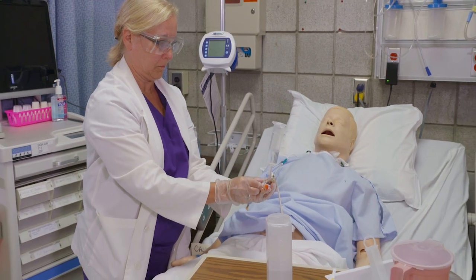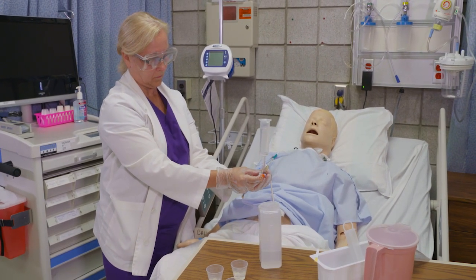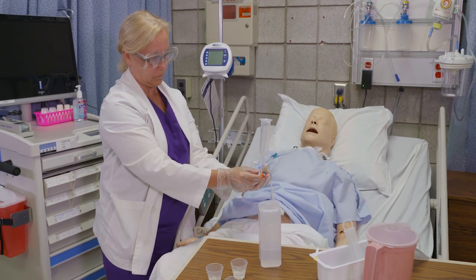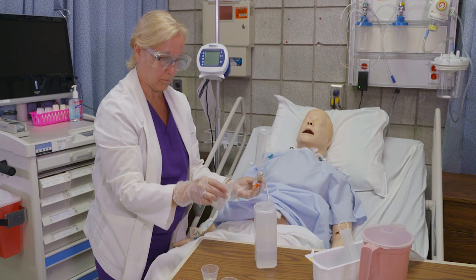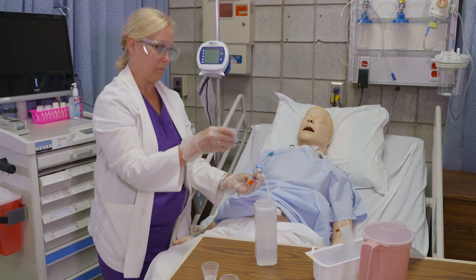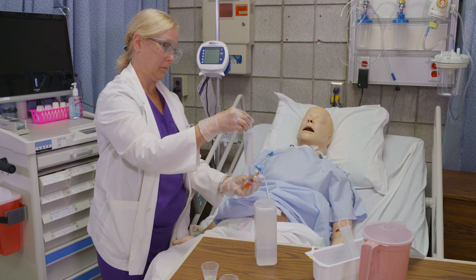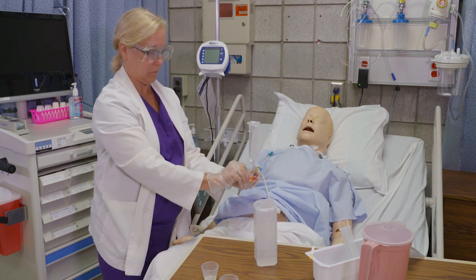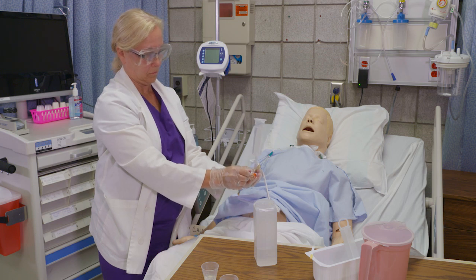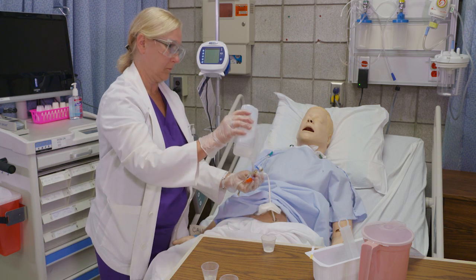Open the stopcock. Allow the water to flow into the tube by gravity. Administer medications into the syringe, allowing them to flow by gravity, but do not pour medications into the mannequins in the lab. Administer 10 milliliters of water between crushed meds and liquid meds.